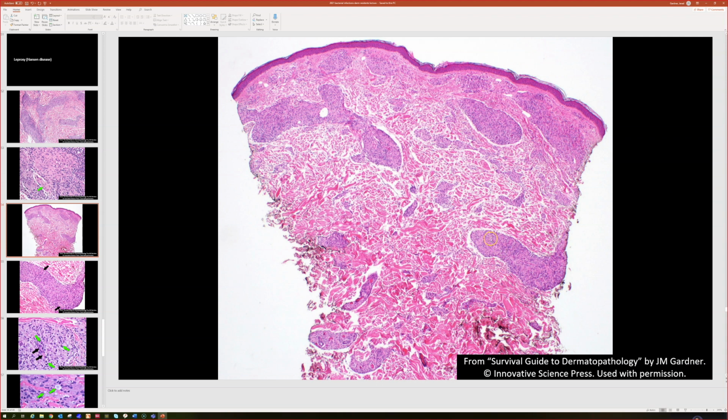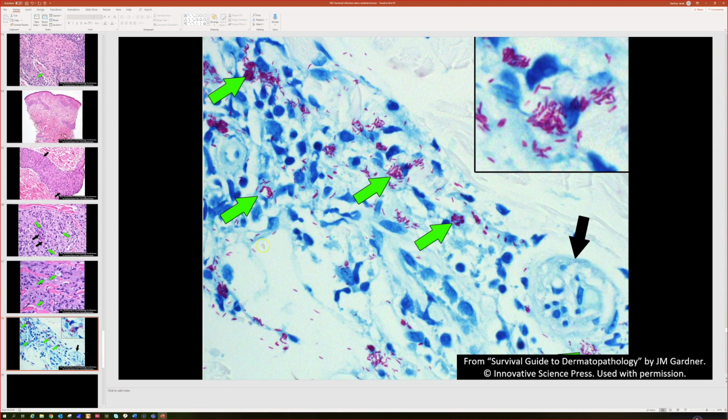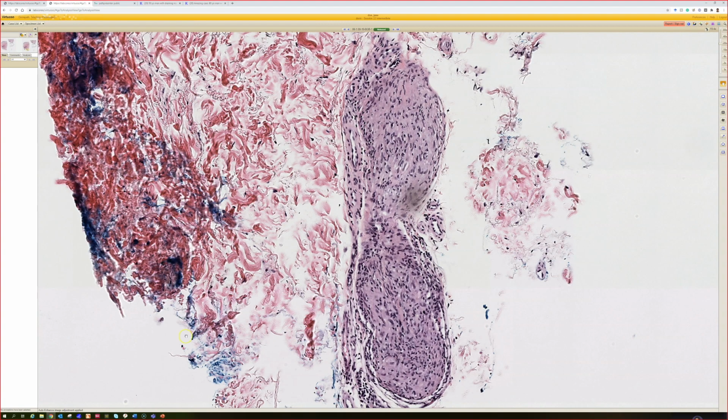The difference is that the cells of these serpiginous granulomas look different than in tuberculoid leprosy, where they're real dense pink. And I know it's a little bit subtle at first. The easy thing is when you do the Fite stain, if you see one or a few organisms, probably tuberculoid. When you see 1,000 organisms, it's going to be on the lepromatous multibacillary end of the spectrum, like right there. Okay, just a couple more, and then we're done.